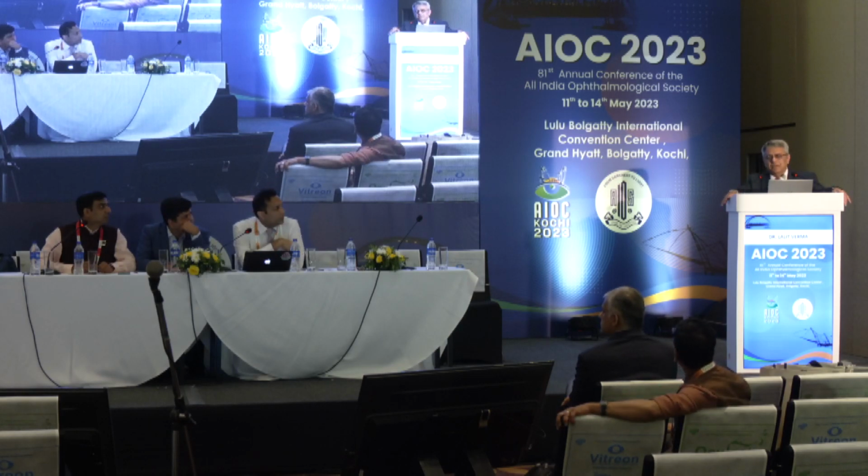You see, if the complaint is diminution of vision, I will allow the cataract surgeon to do the cataract surgery itself. If the complaint is metamorphopsia, then the issue is totally different. Is it possible that after cataract surgery, PVD may get induced? Yes. These two patients which I had shown were actually not after cataract surgery, but they happened spontaneously. I agree that with cataract surgery itself, because of the decreased volume inside, the vitreous body may get shifted slightly, and you may be blessed to have induction of PVD.